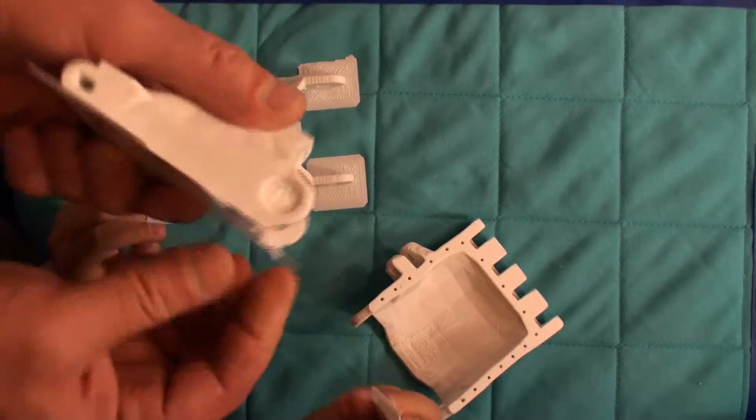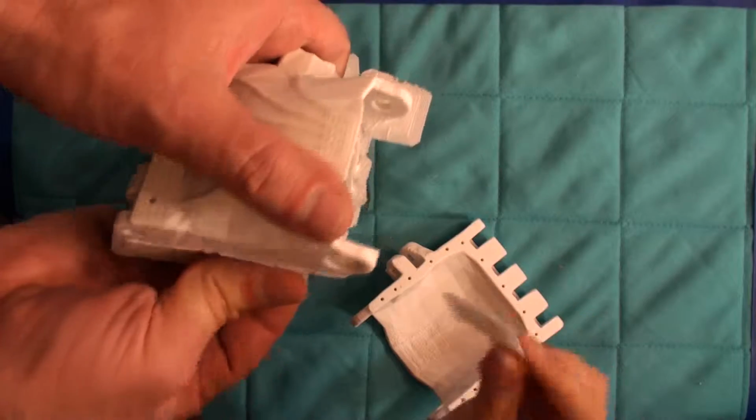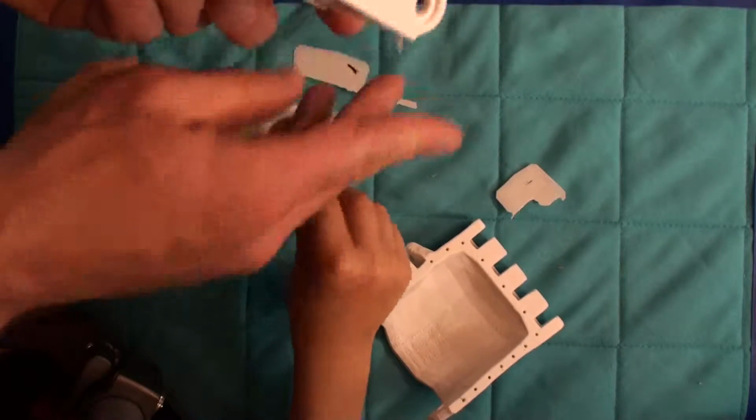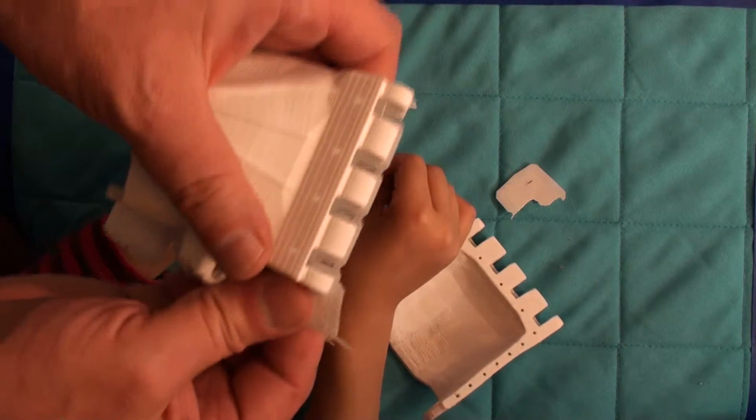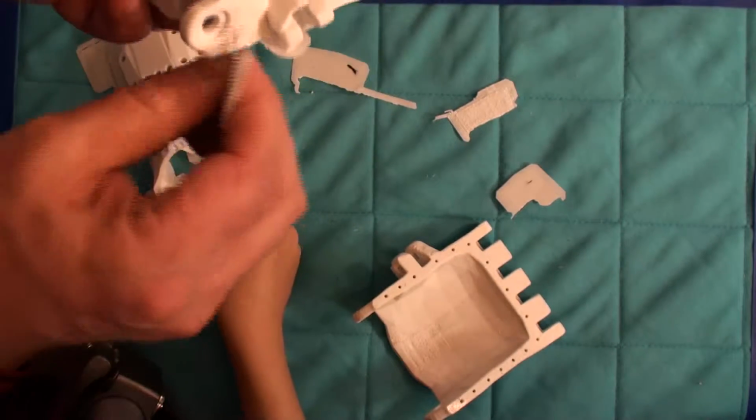See? There we go. And we're actually going to just break off these gecko feet, I call them, but you could call them tree frog feet, and I'm sure other people have run into the same problems and solved this problem this way.